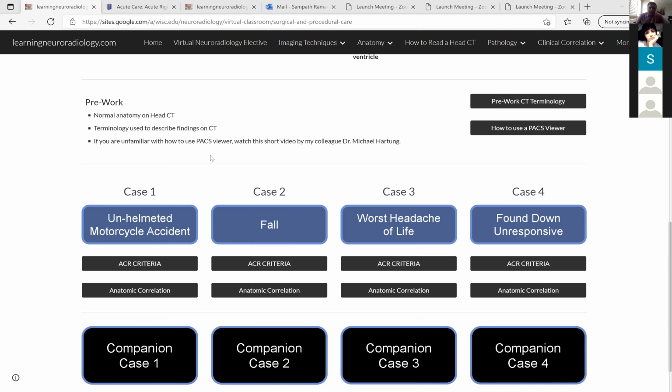If the bleed is not big and the patient does not need surgical intervention, we do either a contrast enhanced CT or a contrast enhanced MRI to see if there is a mass there which tends to show contrast enhancement. So that's a really good question. Yes, tumors do bleed, and that can present to the ER as a big bleed. Yes, absolutely.